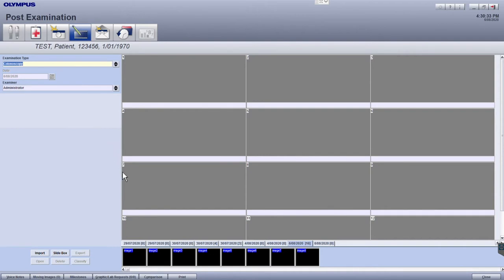At the bottom of the screen, you'll see a filmstrip, with the images you acquired from the Perform Examination module.